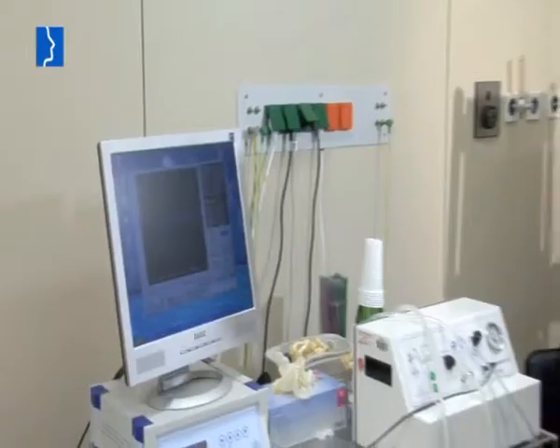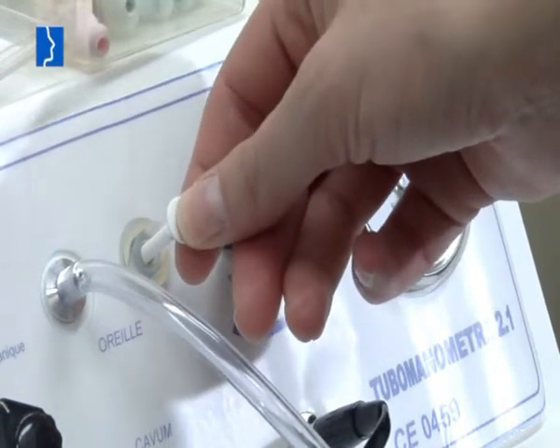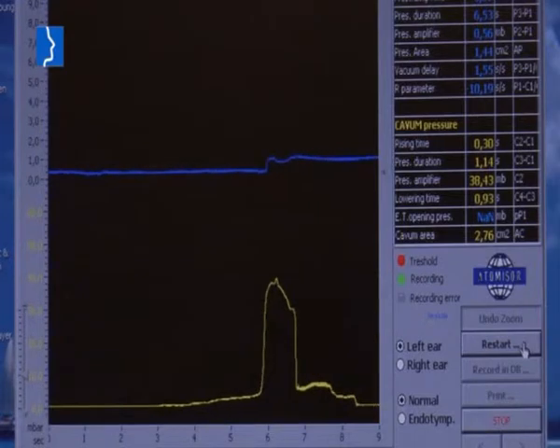A pre-operative tubomanometry is performed on the patients. This examination method lasts only 5 to 10 minutes and allows a detailed and reliable diagnosis of functional eustachian tube disorders. It involves the measurement of the eustachian tube function, according to Esteve, with which one can show whether the eustachian tube opens upon swallowing, which is physiological, and if subsequent pressure equalization takes place in the ear. This means that for the first time, we have the possibility of performing an objective test for eustachian tube function.